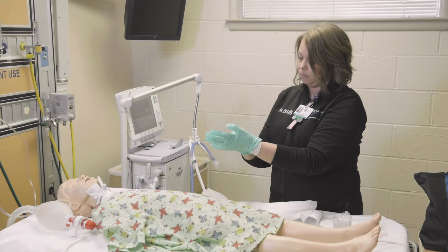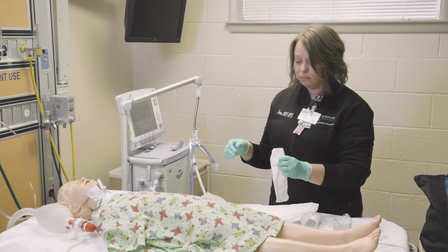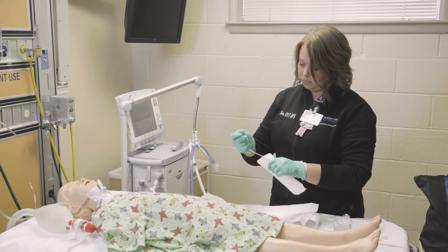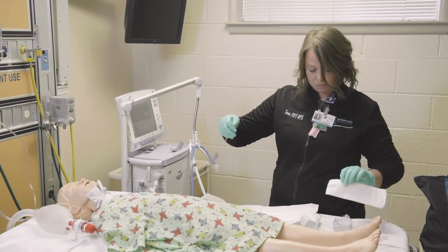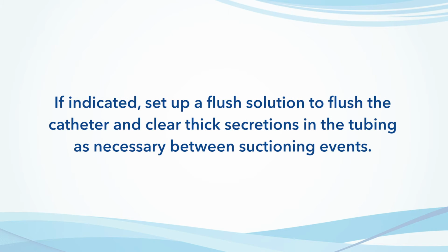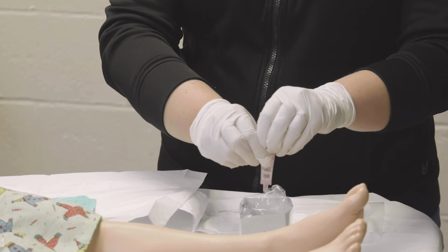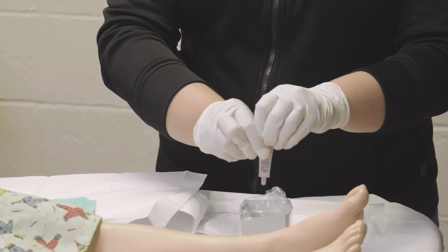Perform hand hygiene and don gloves. Open the sterile suction catheter package on a clean work surface. Maintain sterility on the inside of the package. If indicated, set up a flush solution to flush the catheter and clear thick secretions of the tubing as necessary between suctioning events. Fill the container with enough sterile water or saline to flush the catheter as needed.